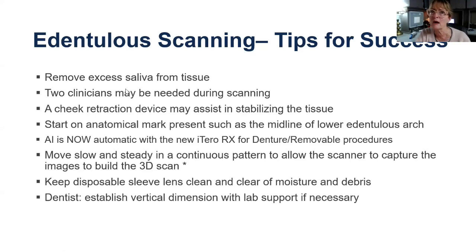So be prepared with some cotton rolls, some 2x2s, maybe even an alcohol pre-moistened wipe that allows you to quickly and easily remove any debris from the wand itself, from the sleeve. Are you scanning the bite in the mouth? Yes, I am scanning the bite in the mouth.